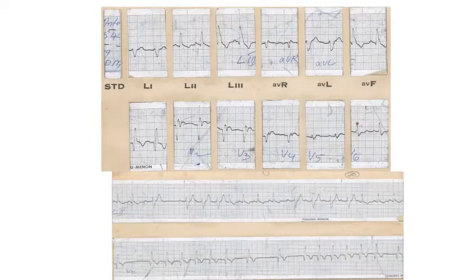Okay, now coming to the rhythm strip. Yes, sir. In the rhythm strip, I can see that the third beat is preceded by a P wave, and the morphology of the QRS has changed from the first and second. First and second are narrow QRS, whereas the third beat is a wide QRS. And fourth, fifth, and sixth are also wider QRS. Again, it is followed by narrow QRS. So there is an intermittent bundle branch block developing.